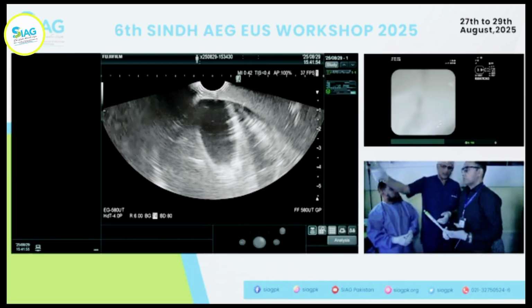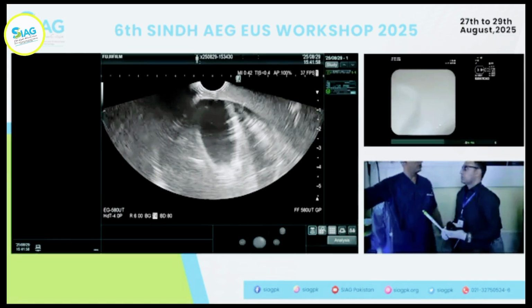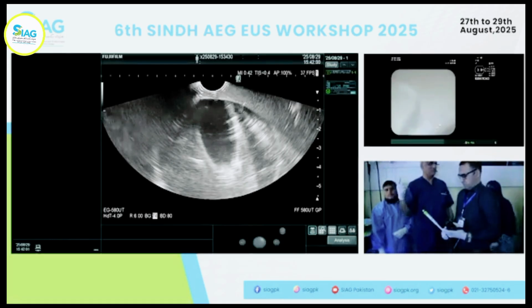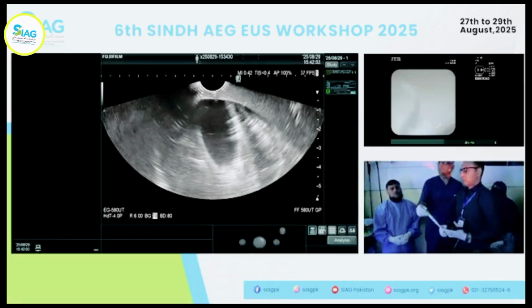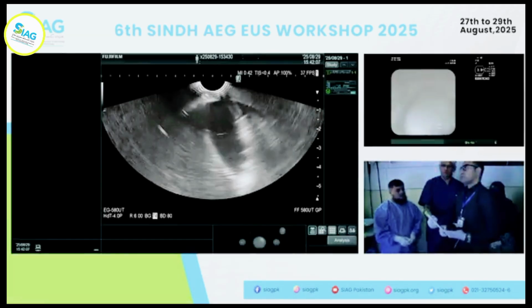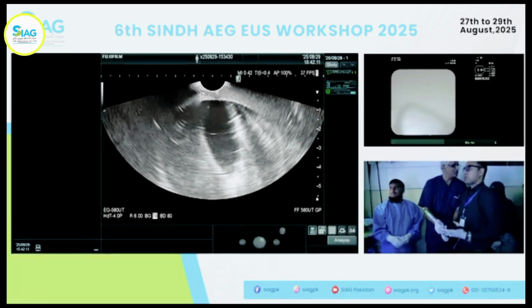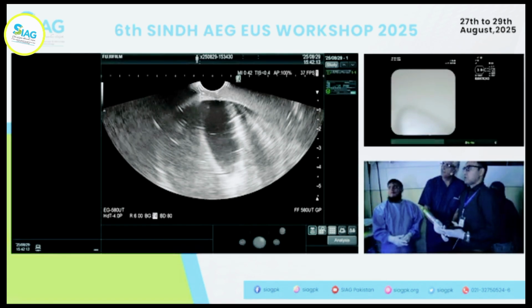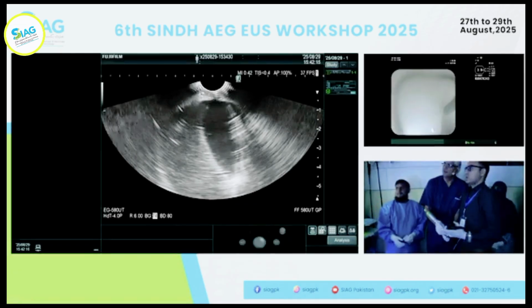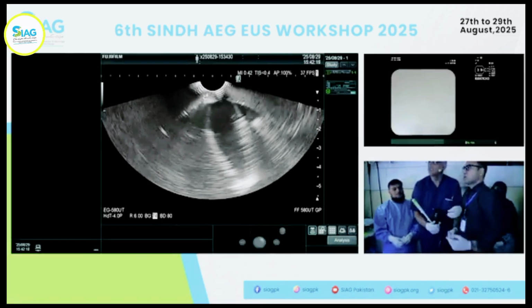But you can go in, and then as you go past this area, you can actually pull back and go in. I usually take it out and just do it straight. So you can actually pull this a little bit. Take the needle out now. इसको खोलें. Open this. अच्छा एक नहीं, you don't need to. Sheath का हम आपको बता दें. Actually sheath का था ना, there were a lot of questions about sheath coming out. Yes. Okay, थोड़ा सा आप अपने big wheel एक second मुझे दिखाएंगे.